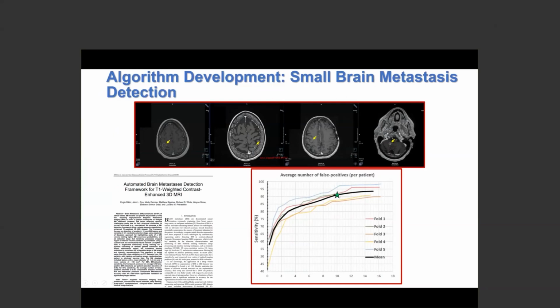So as you can see, not perfect, but from my standpoint, I prefer to go through these 10 false positives and make sure that I'm not missing any and not negatively impacting patient care. So there is a real assistance and an importance to use these tools clinically.